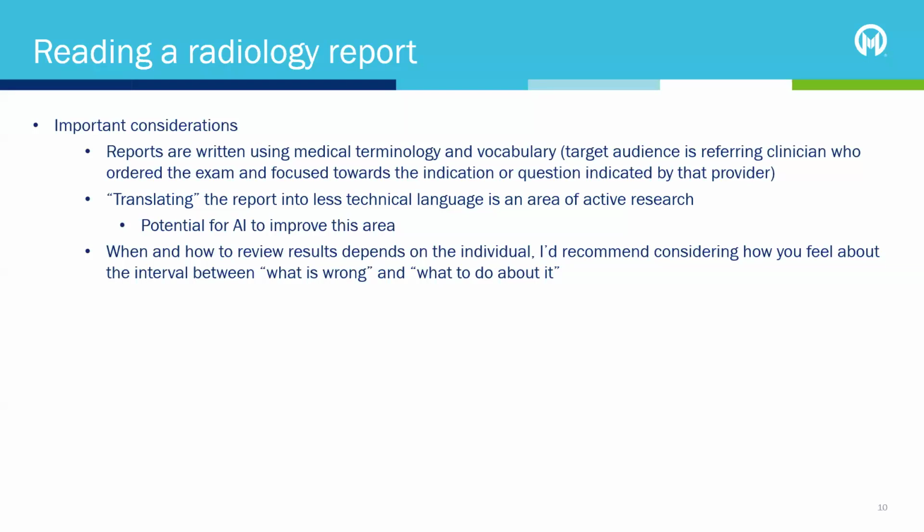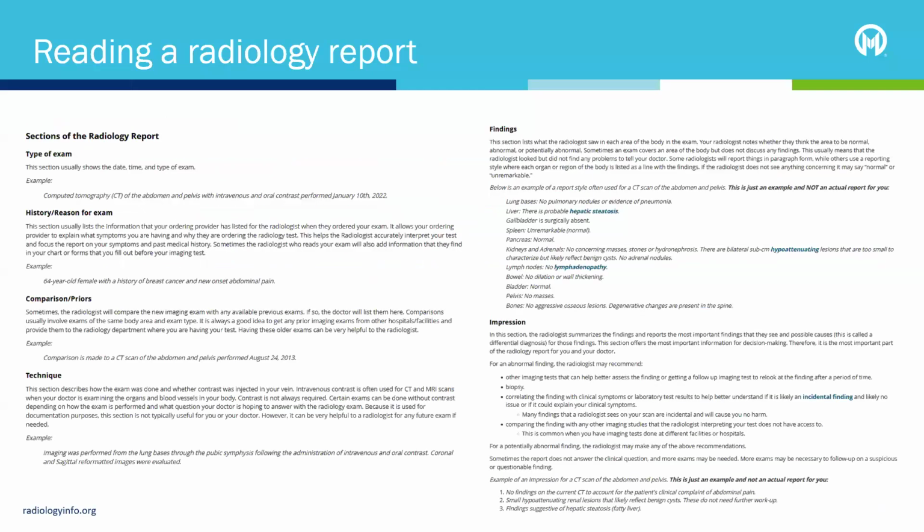I do gastrointestinal, genitourinary stuff. So even doctors sometimes find other doctors' jargon hard to understand. If we go to the report, it says there's probable hepatic steatosis. Well, that's not something you hear every day, right? Instead of liver, we say hepatic. So that's already a little awkward. And steatosis refers to fat deposition in the liver. So it's fatty infiltration of the liver.